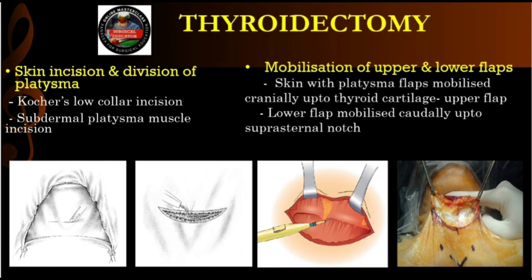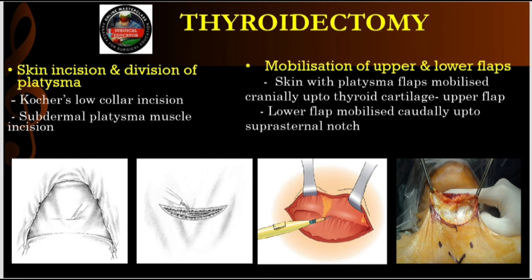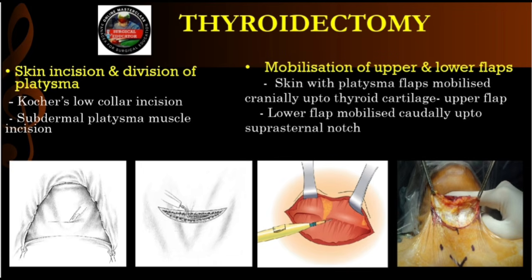You know, before Kocher refined this in the late 1800s, trying to remove a thyroid was considered practically surgical suicide. Really? What was the mortality rate? Around 50%. Mostly from catastrophic hemorrhage or infection. Kocher introduced meticulous hemostasis and this exact incision and dropped the mortality to less than 1%. He won a Nobel Prize for it. We are literally walking in the footsteps of a legend.